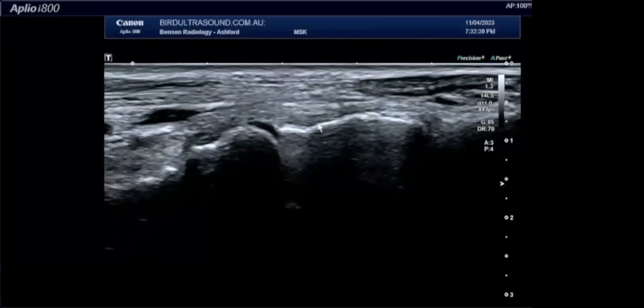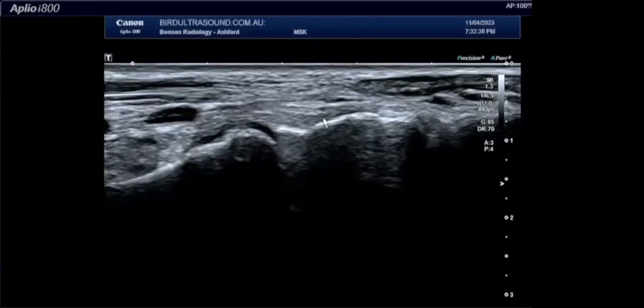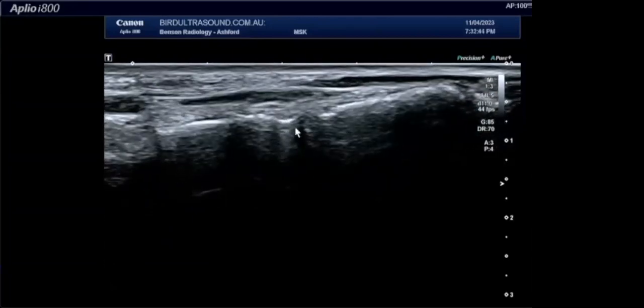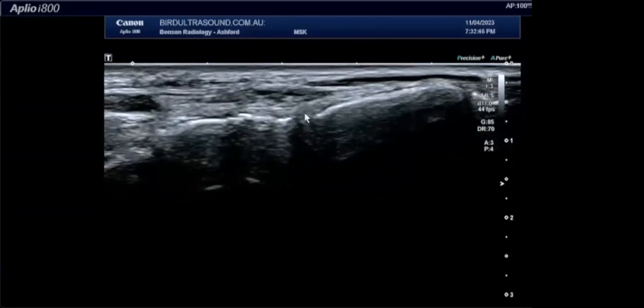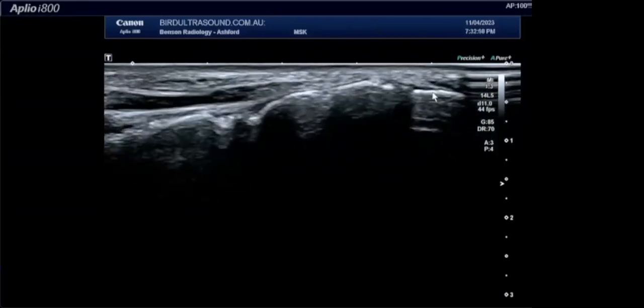And this is, of course, one of the ligaments in the Chopart line of the foot. So by seeing this articulation here, I can already get a bit of a glimpse of the fact that the Chopart line does not seem to have been involved in the trauma here. Then I come straight down the foot a little bit further, and this is the navicular intermediate cuneiform articulation. And then this is the intermediate cuneiform base of second metatarsal articulation.